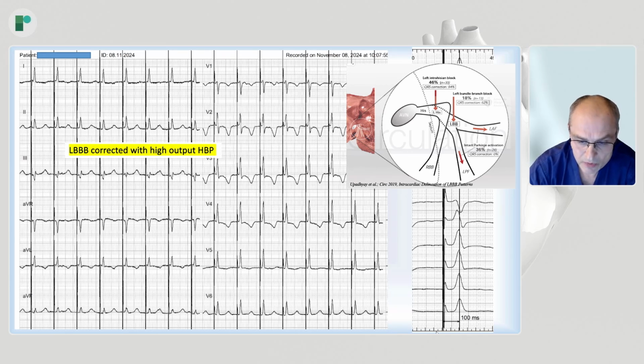Another insight from that moment is that we know what is the R-wave peak time of a normal QRS. It's 100 milliseconds. That will be a reference value for us later on. We'll see. Let's please change the slide.